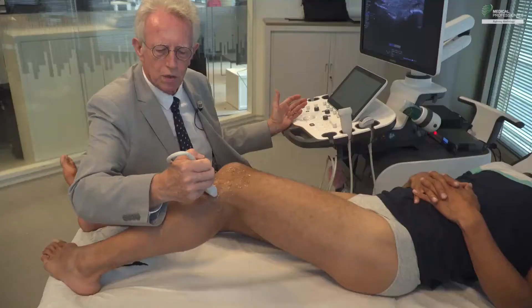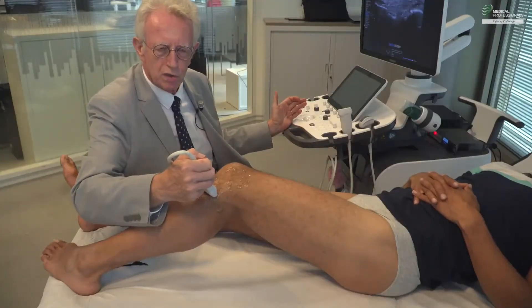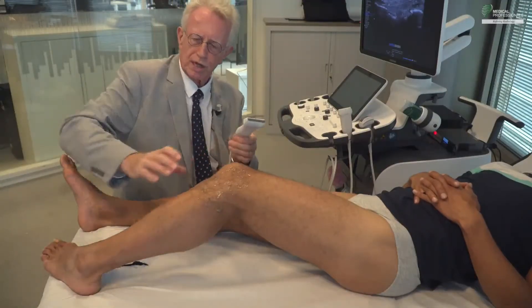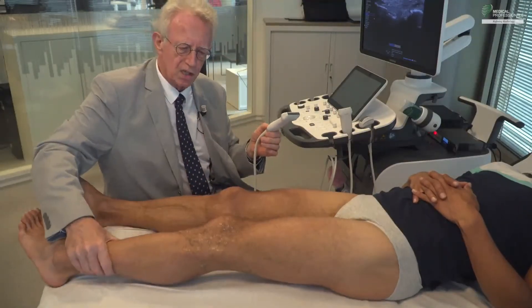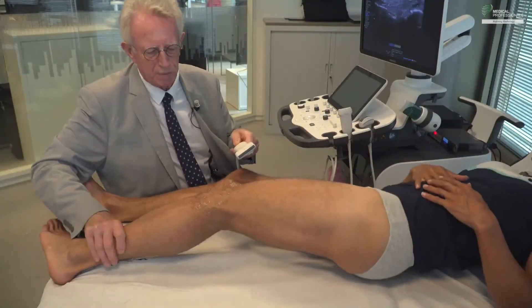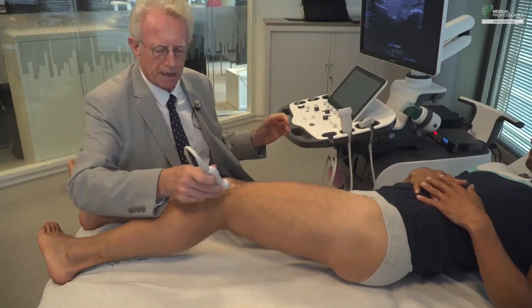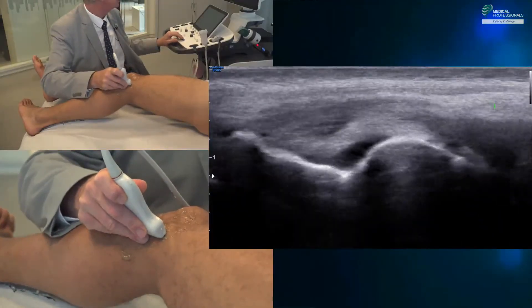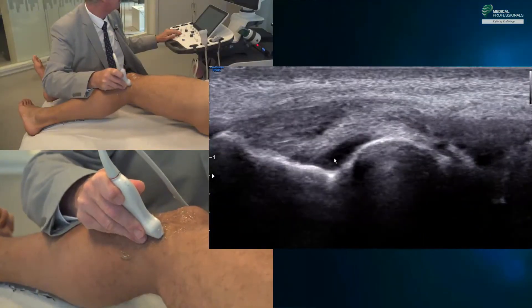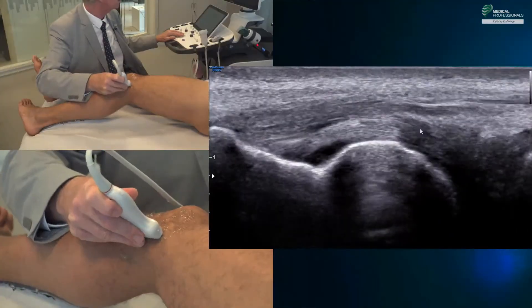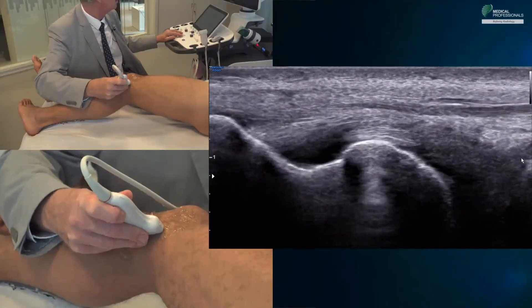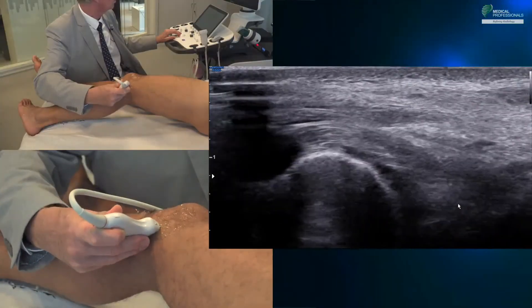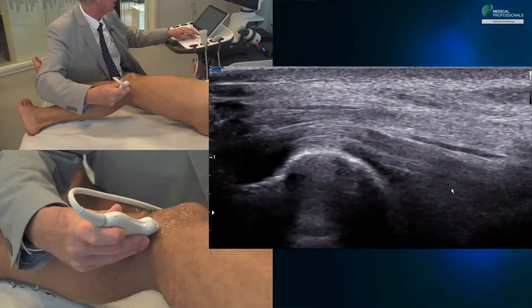It remains for us to study the popliteus tendon. For that, we ask the patient to turn around slightly. Starting again from the small hollow at the lateral part of the condyle, we turn the probe slightly and study the passage of this popliteus tendon, lowering the focal length a little and increasing the gain slightly to perfectly visualize the passage of the popliteus tendon on the surface of the lateral meniscus.